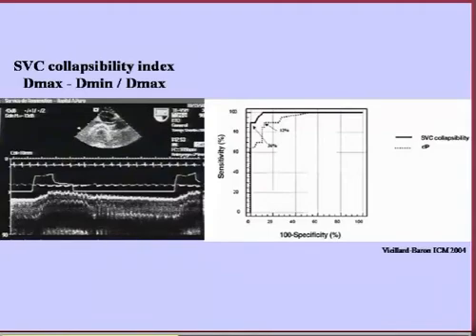And you can see the refilling of the superior vena cava during expiration and the collapse of the vessel during insufflation. When you see this kind of pattern, whatever the clinical situation, my feeling is that you need to give fluids to the patient because there is a significant hypovolemia.